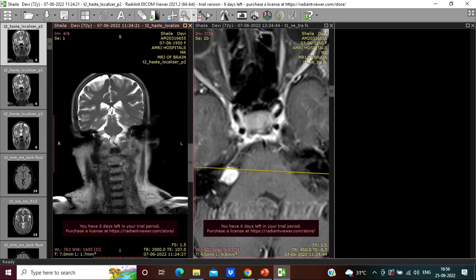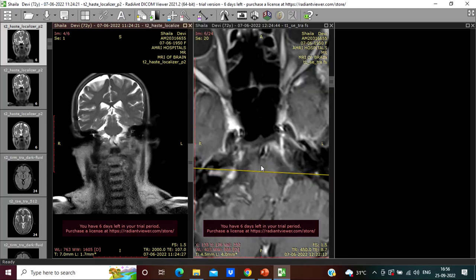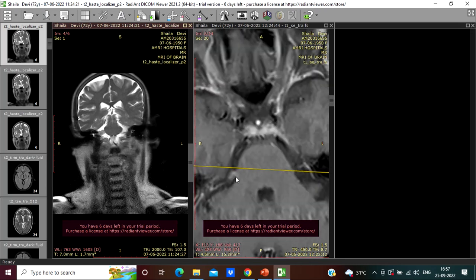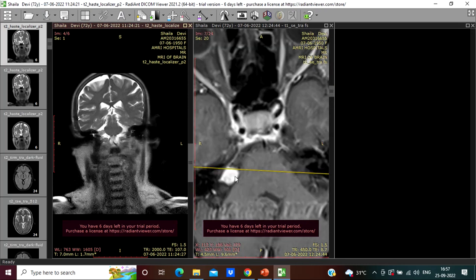So, we have the situation of a tumor, vestibular schwannoma most likely. Now, why can't it be anything else? Yes. How to differentiate from other CP angle tumors? Yes. So, most commonly the meningioma, as I said for the meningioma earlier, meningioma would have heterogeneous density. They rarely invade the internal auditory meatus. They would present with a dural tail mostly. And they have some calcification, heterogeneous density, bony components, surrounding bone erosion and all that.